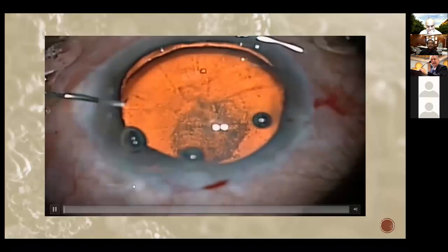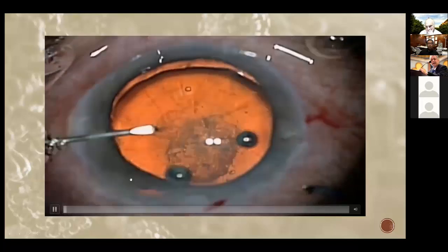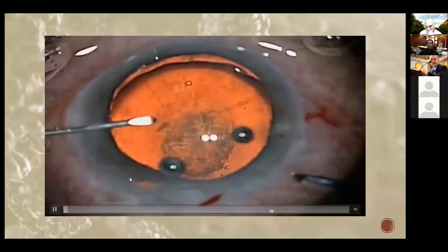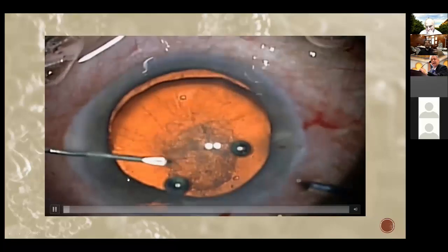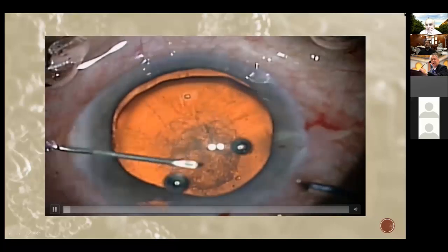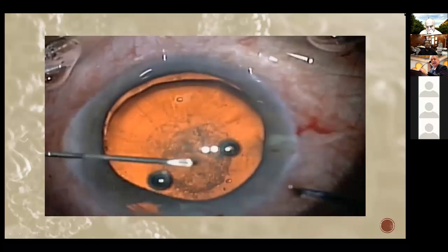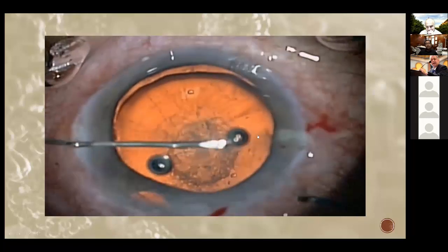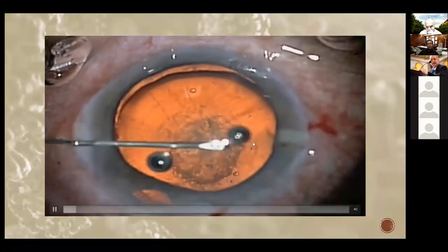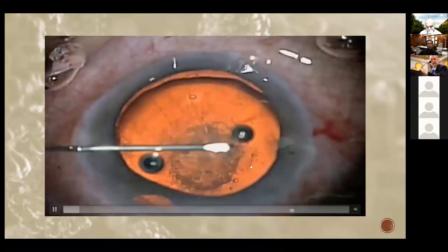In this case, I do my rhexis from the side port. I find doing the rhexis from the side port, as I said, anatomical with my hand. As I move my hand, I get more comfortable with it. I do a shearing movement all the time. My flap is on top of my anterior capsule. It's slow and rounded.